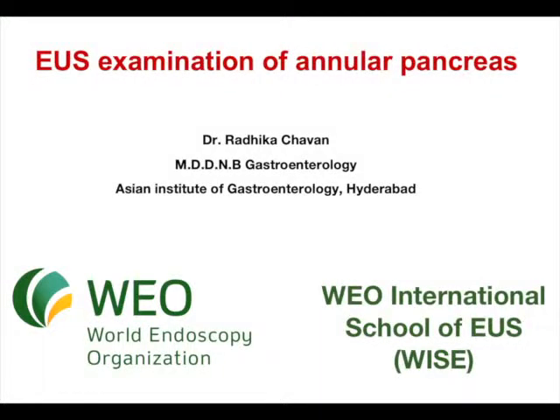In this video we will demonstrate endoscopic ultrasound examination of annular pancreas.